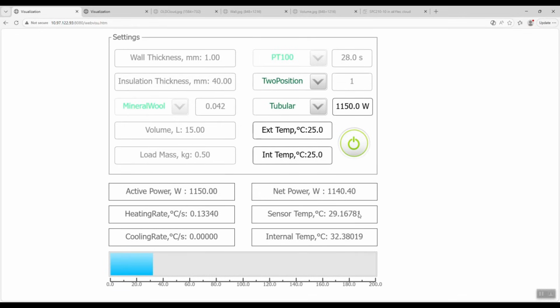This temperature is read by our main sterilizer project from the analog input of the MV210-101 module. The sixth value is the actual temperature inside the sterilizer chamber. As you can see, the temperature sensor readings lag behind the actual temperature during the heating phase, because when the heater is on, the rate of change of the actual temperature increases.